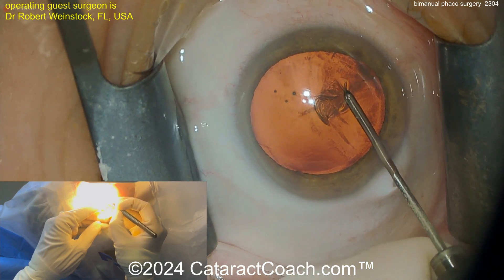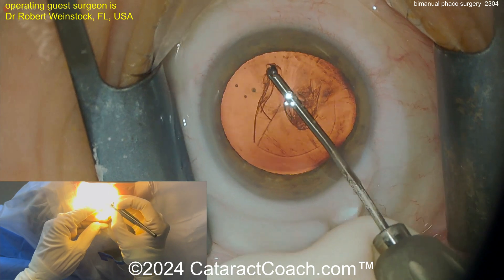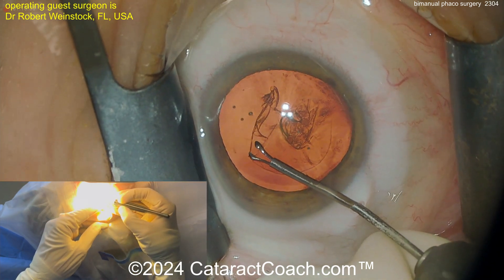Starting off here, using some micro forceps to create a capsulorhexis — that's pretty much routine. Get that rexis done here, that looks pretty good.